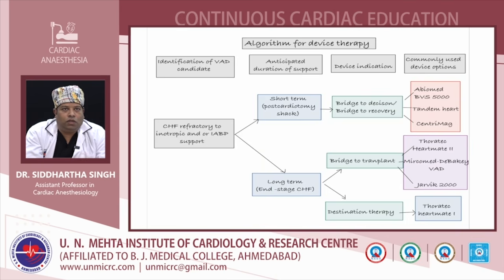So is the patient with refractory heart failure on inotrope and IABP support, but still the hemodynamics are not manageable, then we will think of a short-term LVAD.